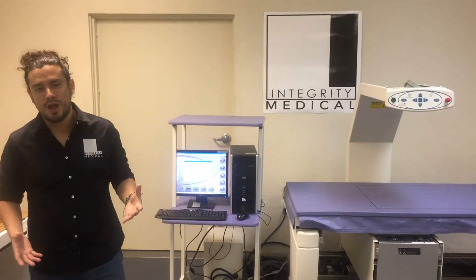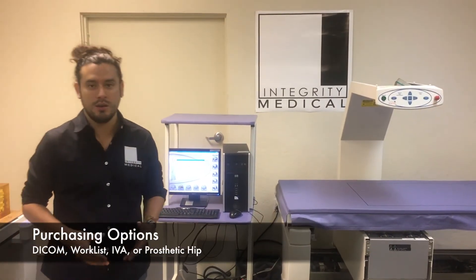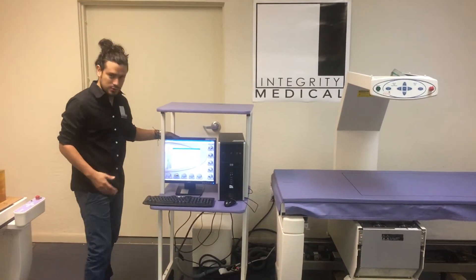With Discovery C, you have different options that you can purchase, like DICOM, WorkList, IVA, or prosthetic hip. Let me show you the standard options here on the screen.